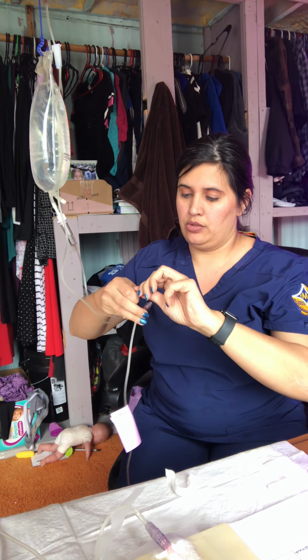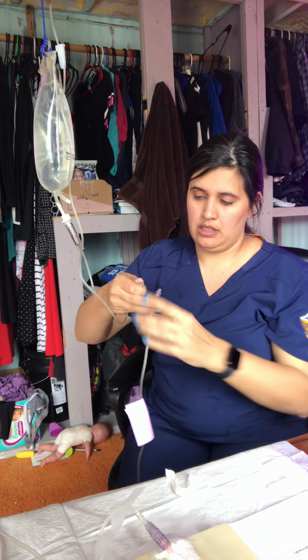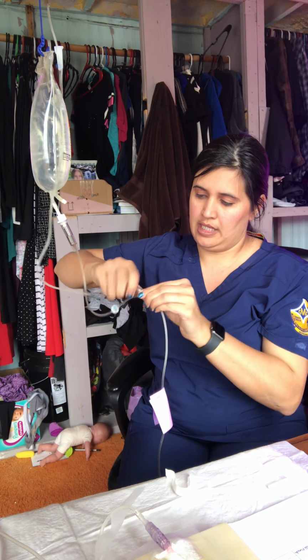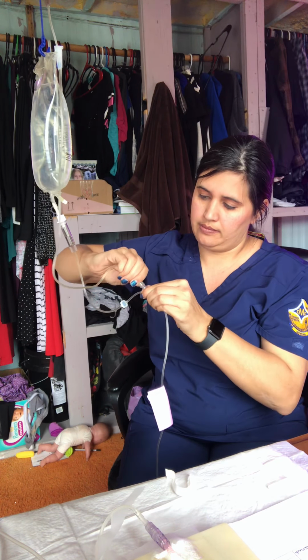I am going to remain sterile and clean. Push in and lock the Luer lock. I'll probably have clamped this before I did everything. Unclamp it and unclamp this so it gets into the correct drop rate. And then let that go for medication.